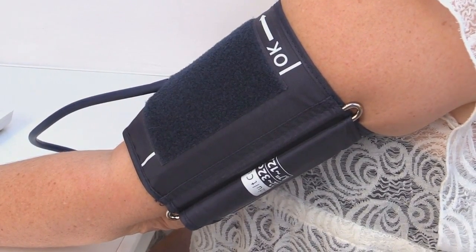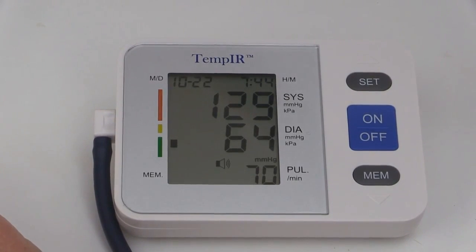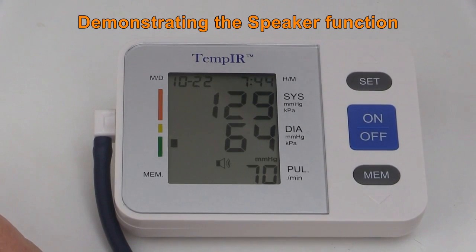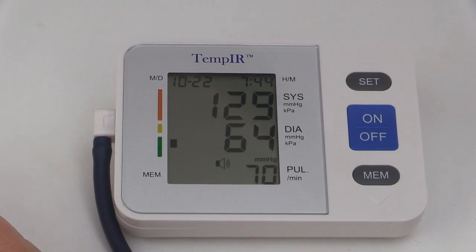When the measurement has been taken, it will be displayed on the LCD screen. There is a World Health Organization classification indicator for your guidance. For example: systolic pressure 129 mmHg, diastolic pressure 64 mmHg, heart rate 70 times per minute. The measurement result is: Normal.